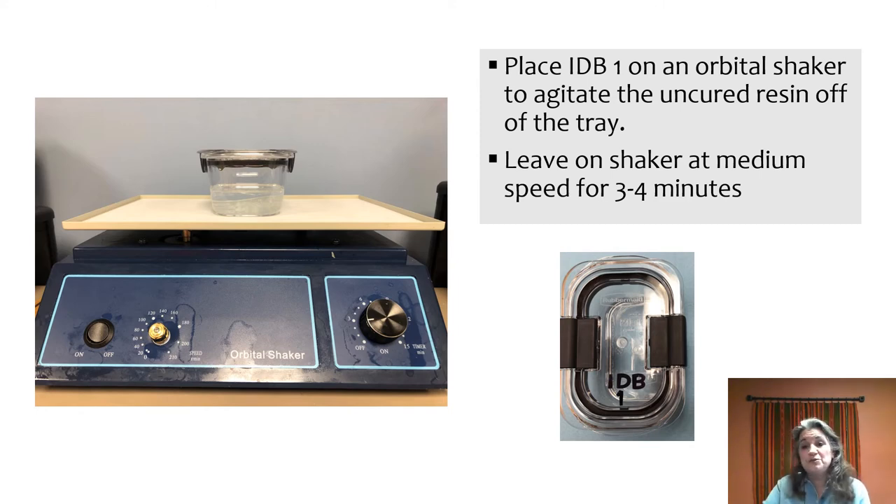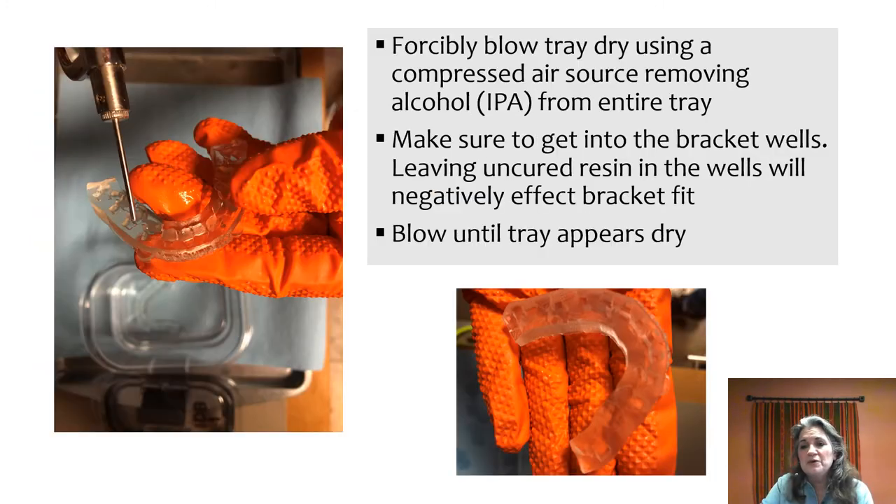Leave it on the orbital shaker for about three to four minutes. When you remove it, forcibly blow air to remove the alcohol and the resin now suspended in it. You really want to get into the bracket wells, because if you leave resin in the well and it becomes cured, the bracket just won't fit. Blow those wells until they appear to be dry.